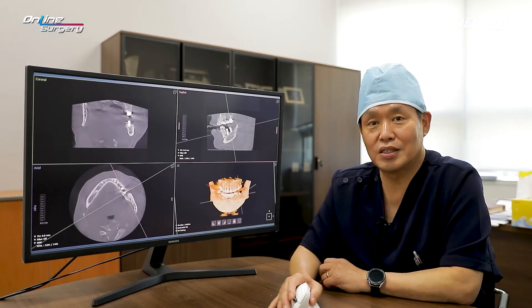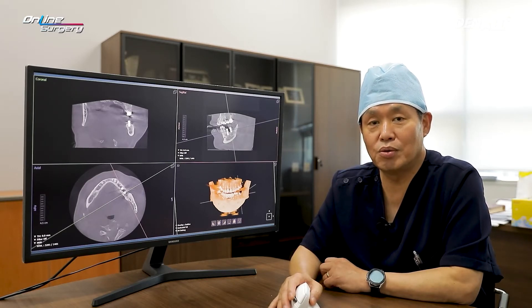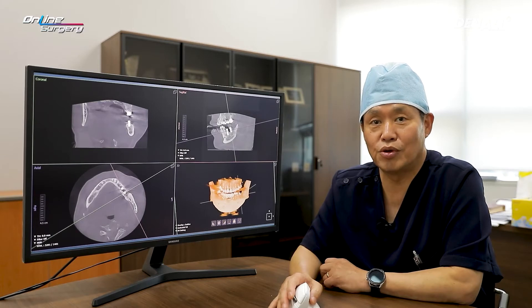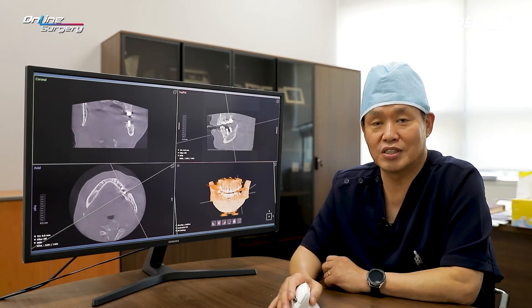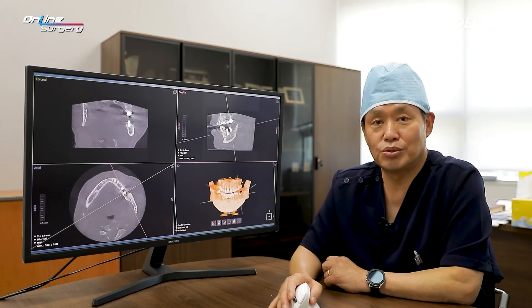Looking back, distal to number 37, I wish I would have done a little bit of a bone graft. However, there were no major issues.